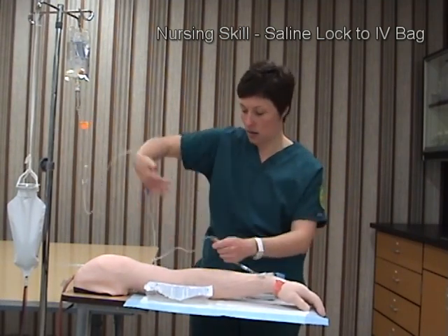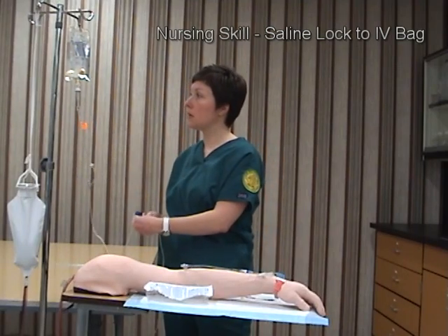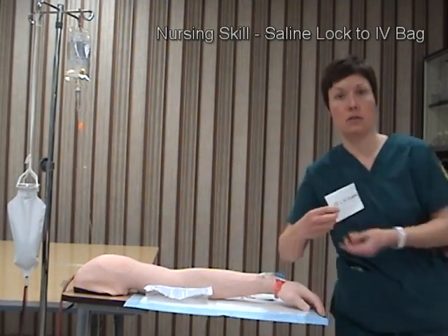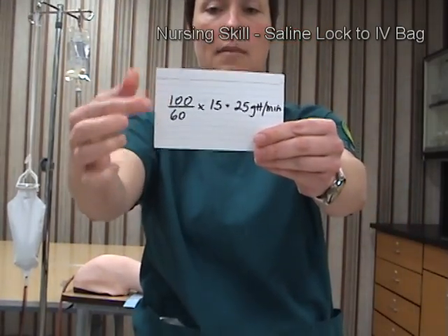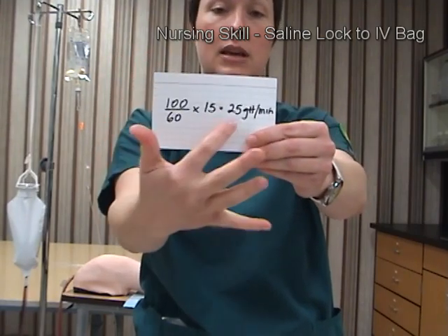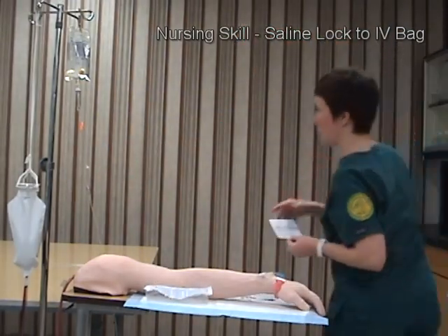I will unlock the port and open the roller clamp to the prescribed flow rate. I'm going to run 100 mL over 60 minutes at a drop factor of 15, which gives me 25 drops per minute. I have set my rate.